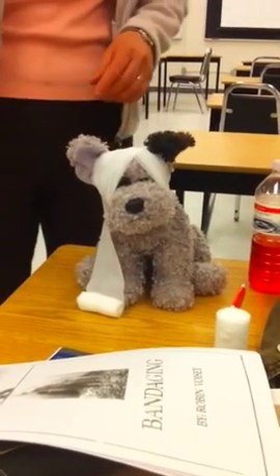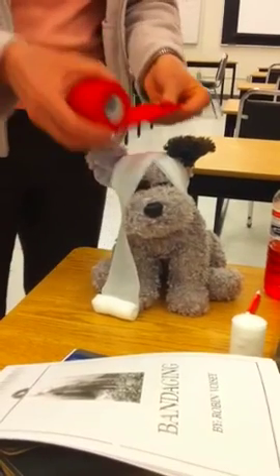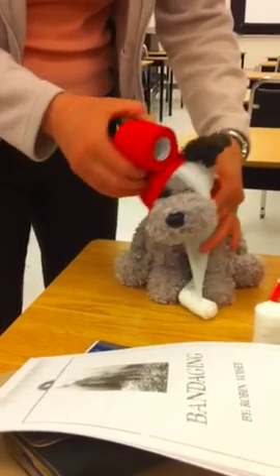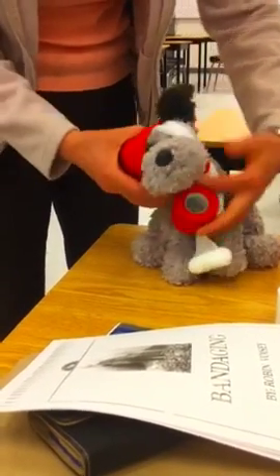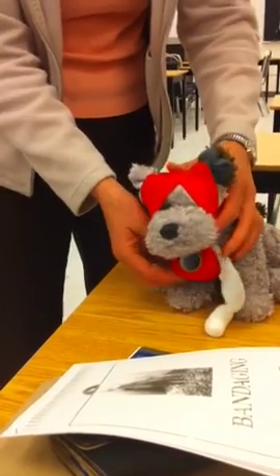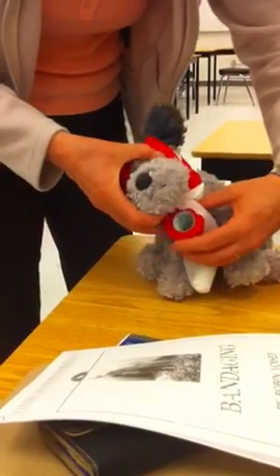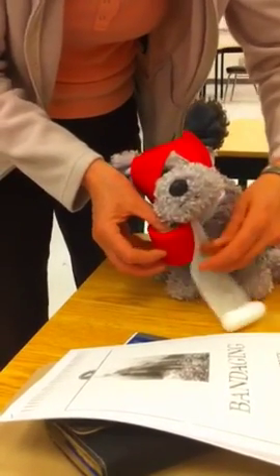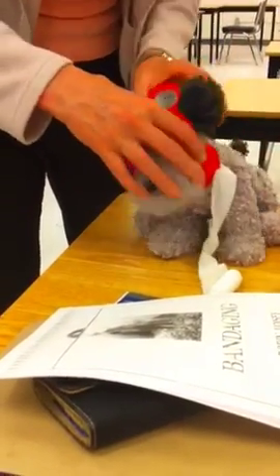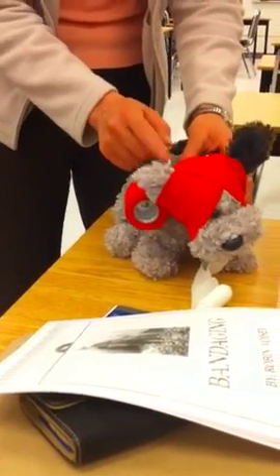Do you put this on top? Yes. So then your vet wrap — skin side down. The vet wrap, you're just going to do exactly the same thing. You do your first diagonal and go under the chin, and do your second diagonal. And Abby's head is bigger so it's always easier. Wherever you end, just go under the chin. Cut it. Then you'll have a piece of tape so that the vet wrap doesn't undo.